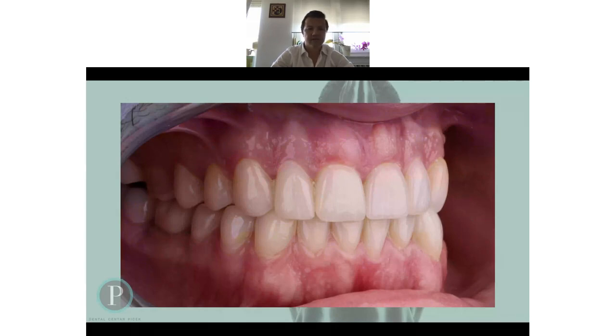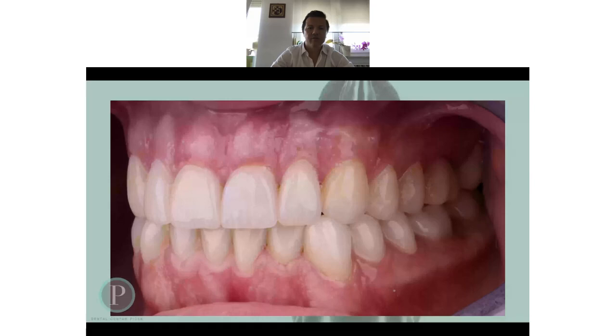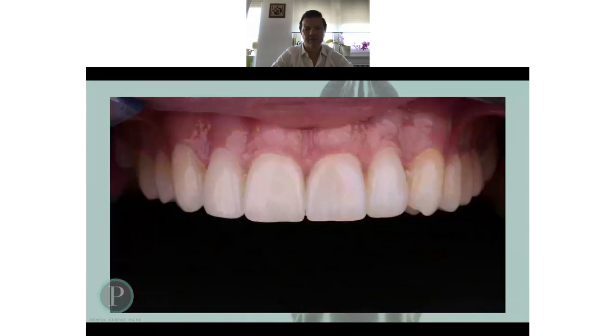I think I decided without asking him, but I will never prepare the whole crown for such a case. I think this was a very good outcome. It was a very hard cementation for this patient, because he has so much saliva, and when he was speaking, he was very healthy, very young, and we had problems securing the area without saliva and keeping it dry.